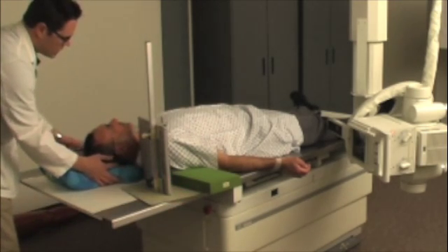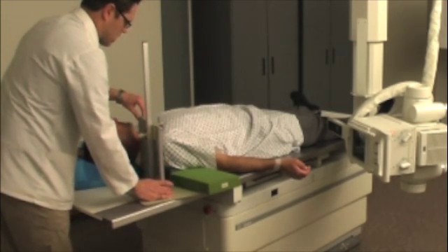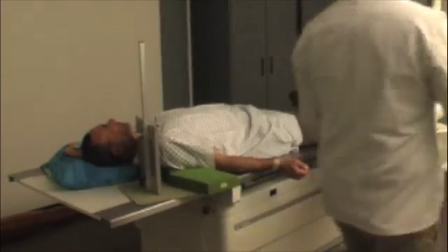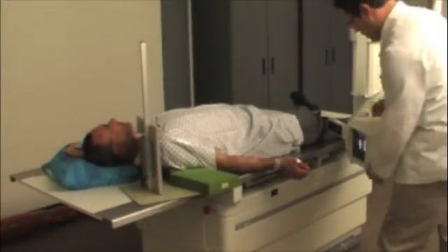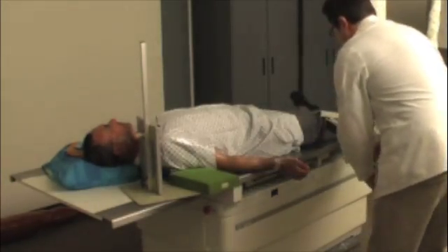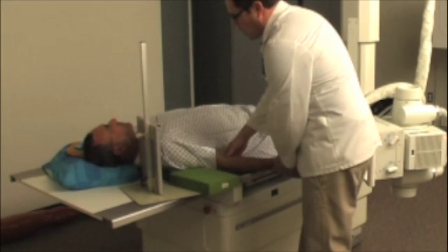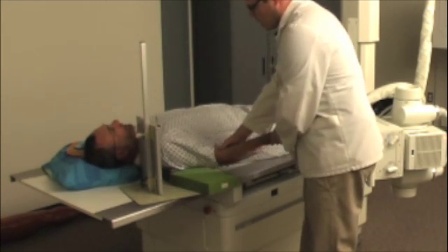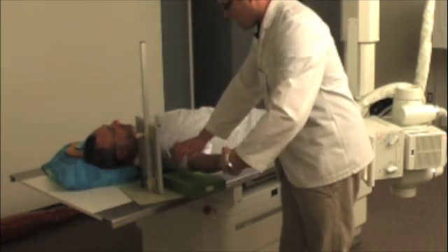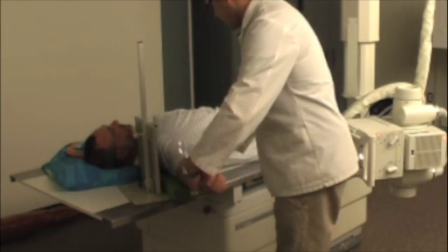What I'm going to do is actually turn your head to the left just a little bit. There you go. That's great. That's going to be a little tight there. Now what I'm going to do is bring your arm out away from your body, okay? We're going to go nice and slow here. There you go — I've got a cushion you can rest your arm down on. There you go, just like that.